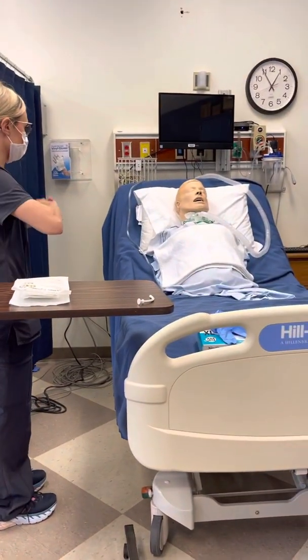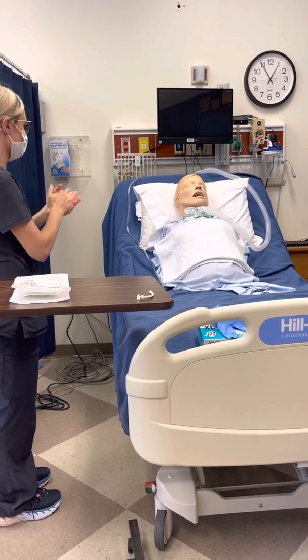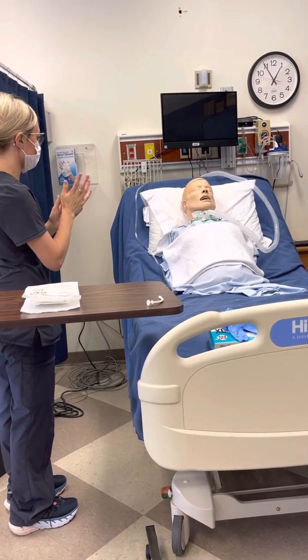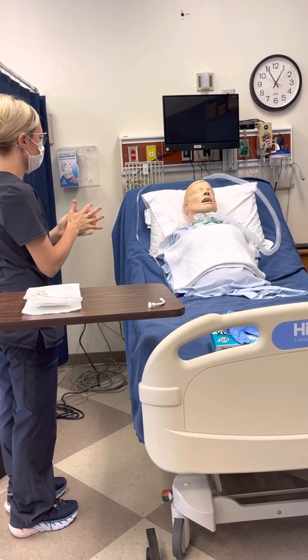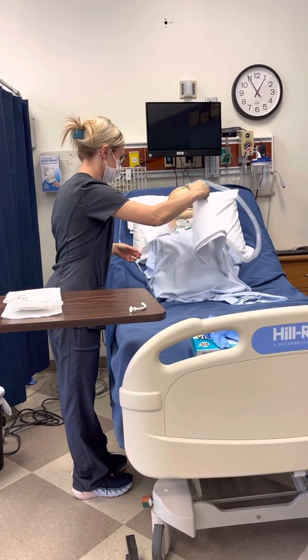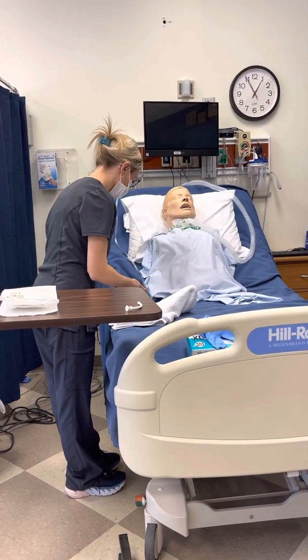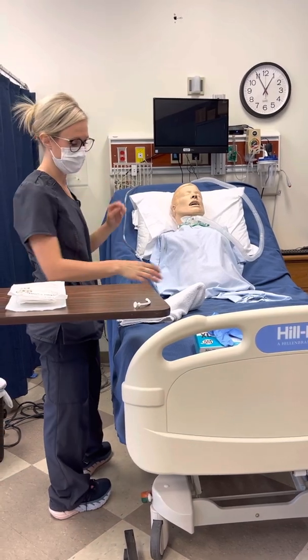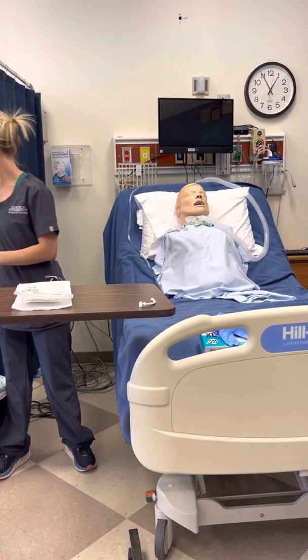Knock, knock, Mr. Jones. My name is Madison, and I'm going to be your student nurse today. Today I'm going to be performing suctioning on your trach. Is that okay? Perfect. Okay, so I'm just going to remove this here. Can you tell me your name and your date of birth? Very good, thank you. And I'm going to make sure that I have provided privacy before beginning.